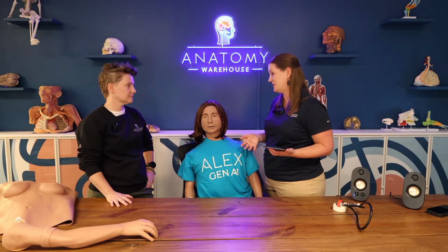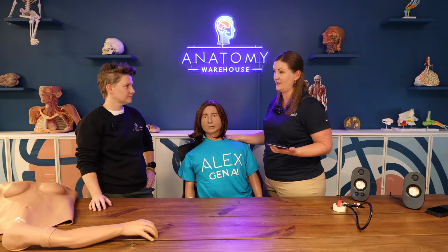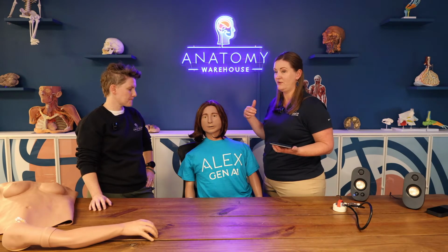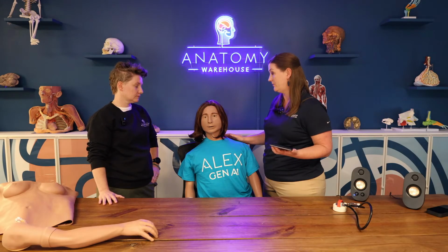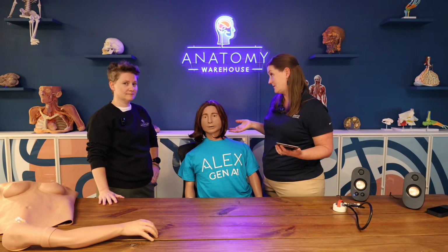Yeah, so the AI has been super influential for having that simplistic, easy, flowing conversation with what presents as a patient or whomever that practitioner needs that patient to be. So Alex is super leading edge because it's not like this is a standardized patient who might go off script or might have other physical ailments that the students might pick up on. Alex is always going to effectively communicate in the same way every time and create that consistency in learning that health educators really need and desire with patient mannequins. So Vivian was super healthy and easygoing, but we can talk to somebody else if you like.